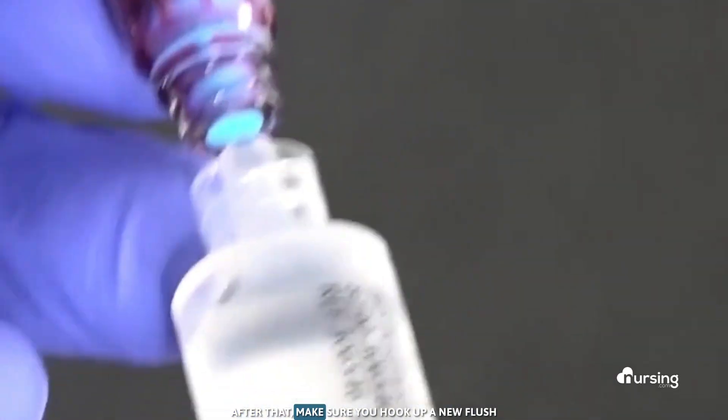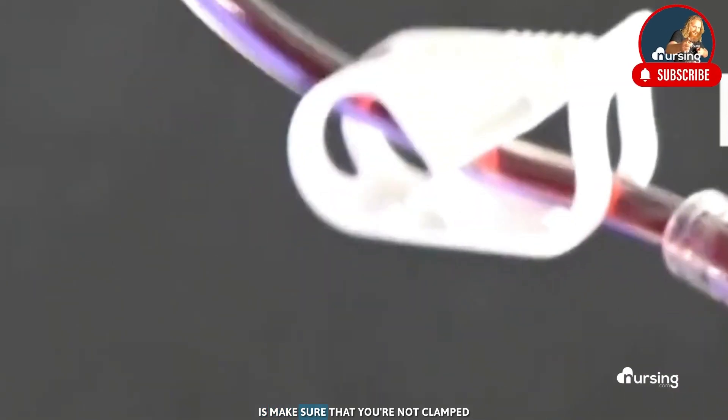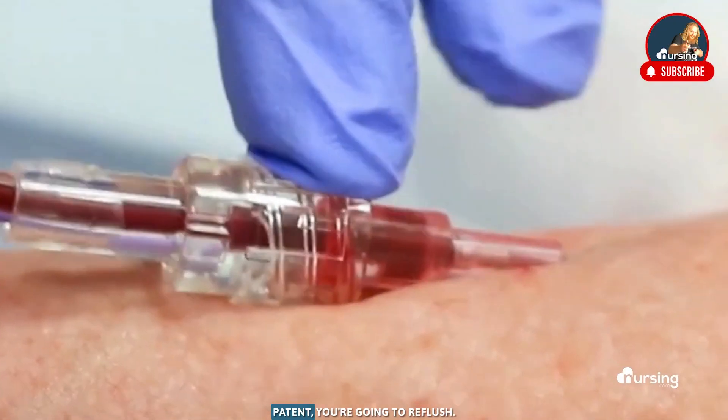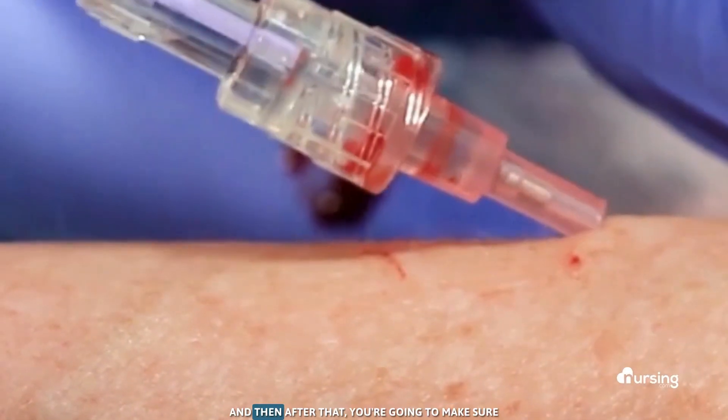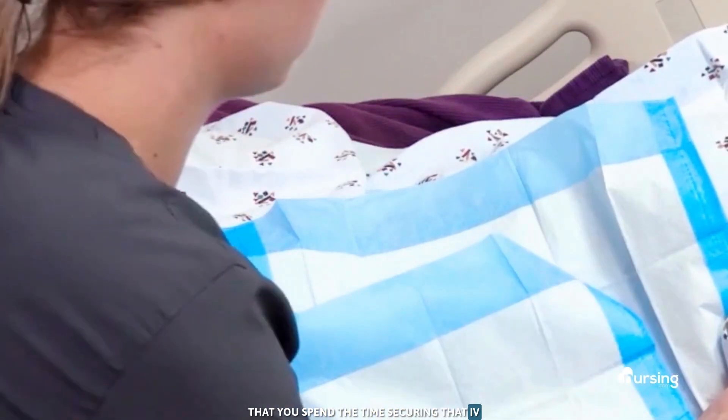After that, make sure you hook up a new flush and flush that line that you just worked really hard to get. Grab a new flush and flush it. Also make sure that you're not clamped — to keep that line patent, you're going to reflush. After that, make sure you spend the time securing that IV.